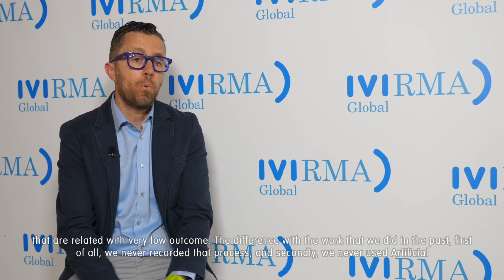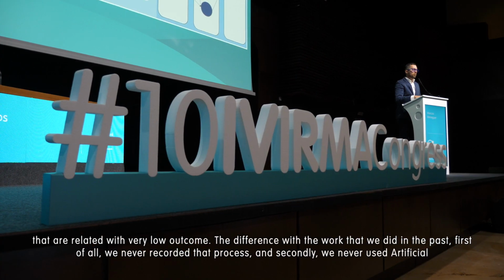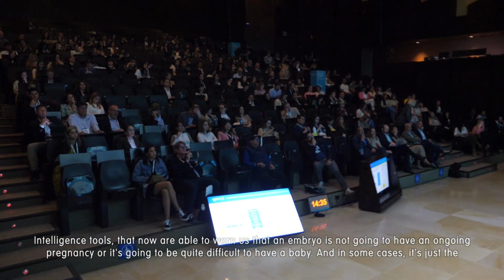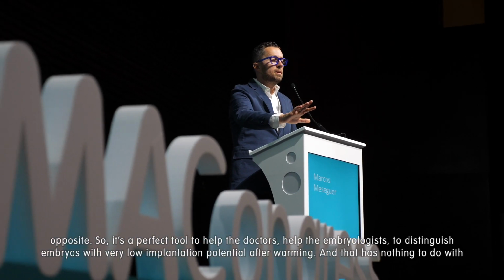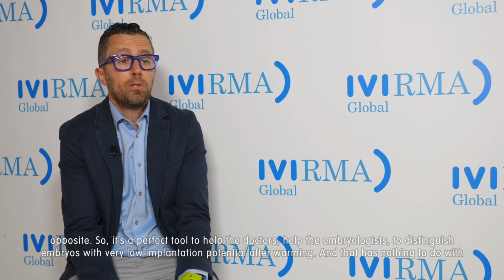The difference with the work that we did in the past is, first of all, we never recorded that process, and secondly, we never used artificial intelligence tools that are able to warn us that an embryo is not going to have an ongoing pregnancy, or it's going to be quite difficult to have a baby, and in some cases just the opposite. So it's a perfect tool to help the doctors, help the embryologists to distinguish embryos with very low implantation potential after warming, and that has nothing to do with the quality of the embryo.